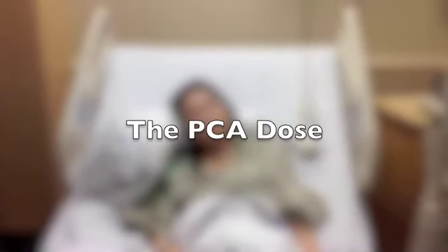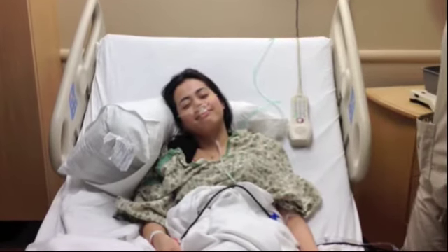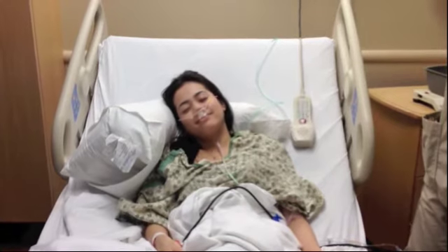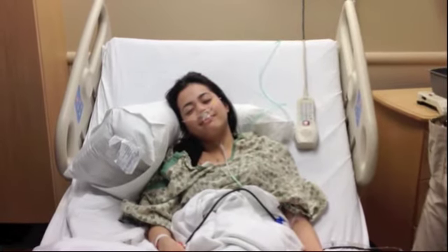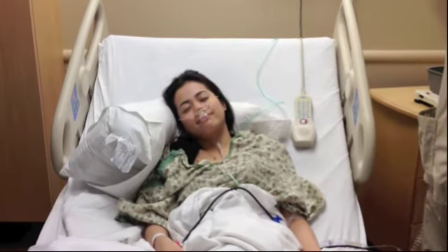The last dose is the PCA dose with a continuous dose attached. This just ensures that the patient will get pain management even though they are not pressing the PCA bolus button. For example, if a patient is sleeping, they will still get a continuous set of pain management.